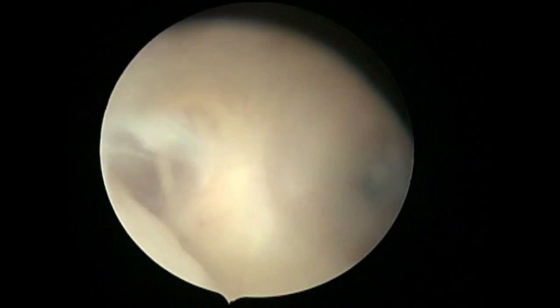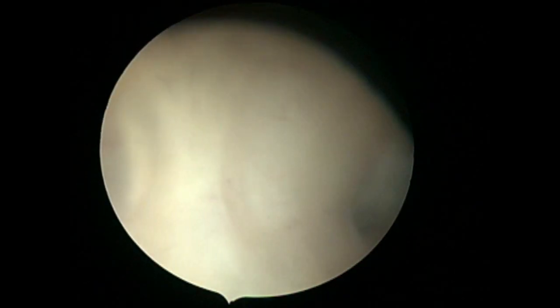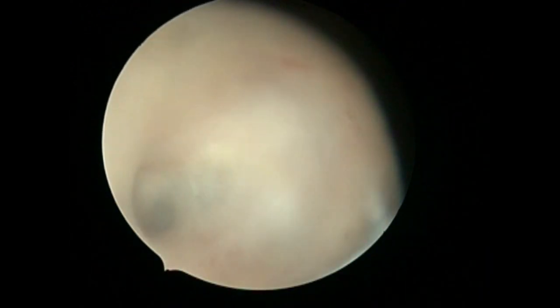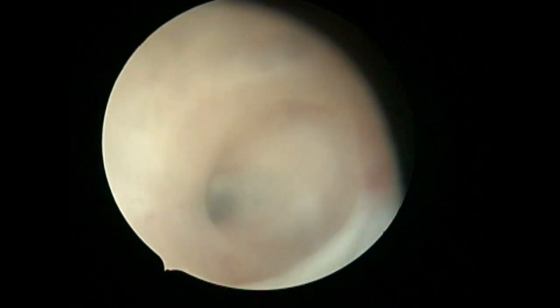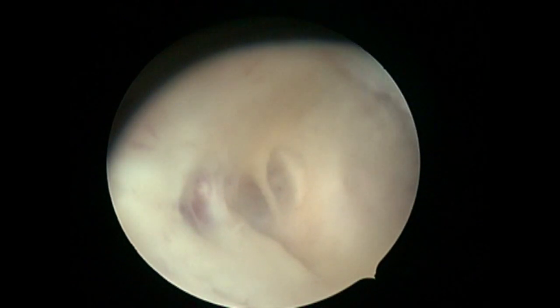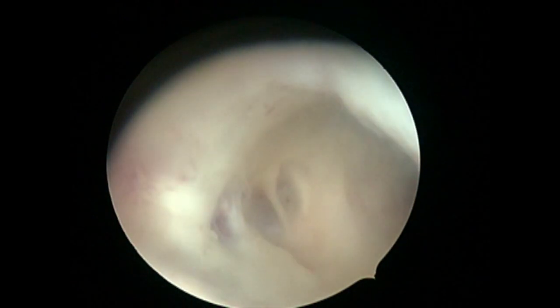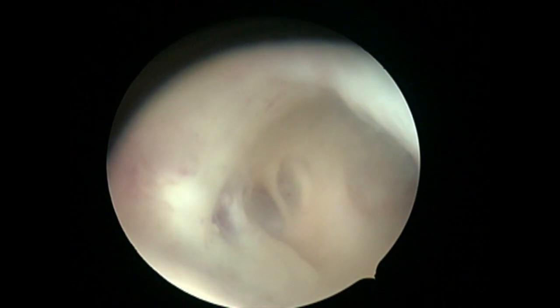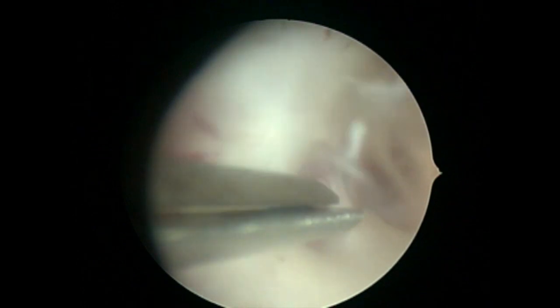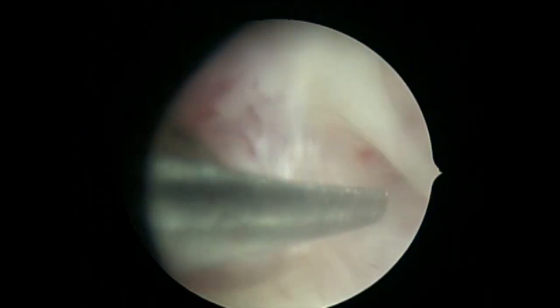Once inside the cavity, we look for landmarks. Here we see what looks to be the left tubal ostia as well as dense adhesions in the midline and in the right cornua. We start the resection with cold, semi-rigid scissors on areas we know to be scar tissue.